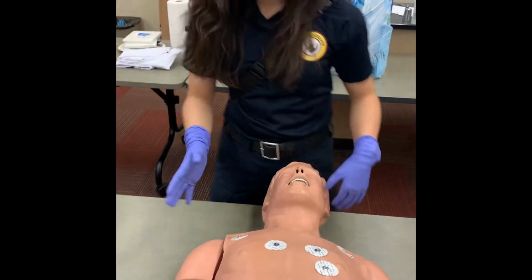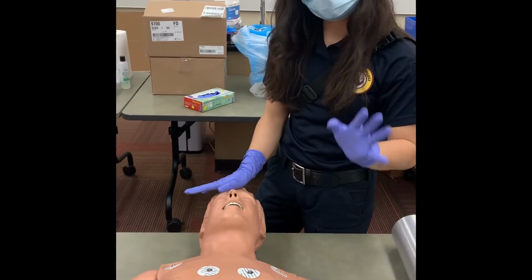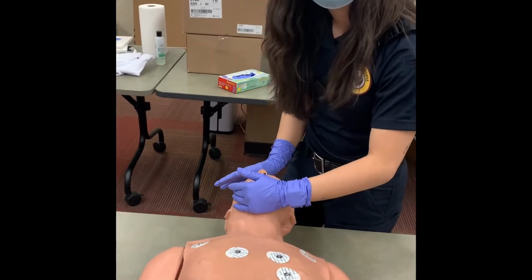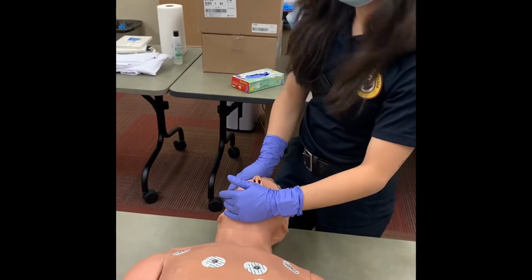Okay, so I'm gonna go ahead and manually open the airway using the head tilt chin lift. So how does my airway look? The mouth is full of secretions and vomit. Okay, so I'm gonna go ahead and suction.